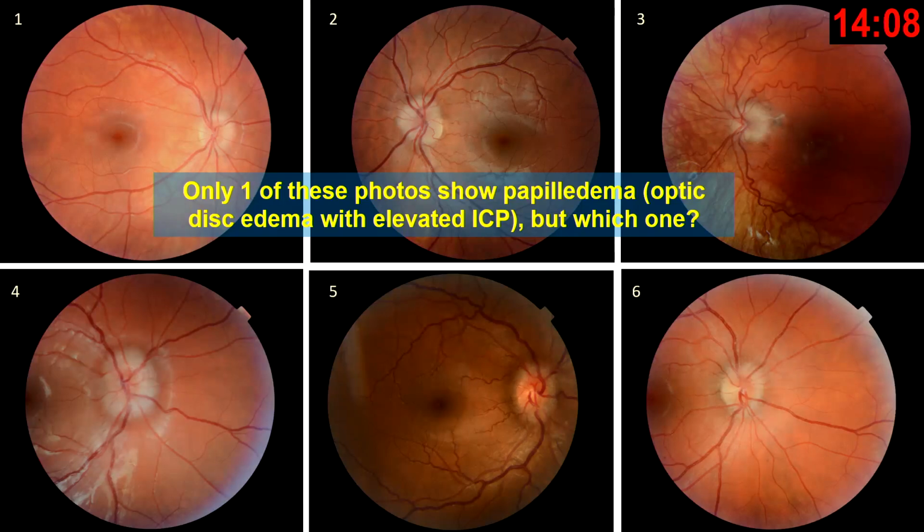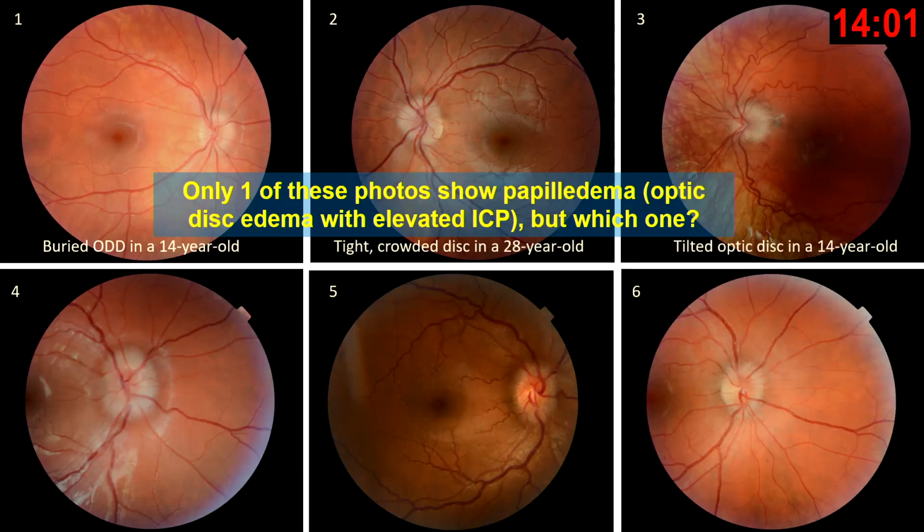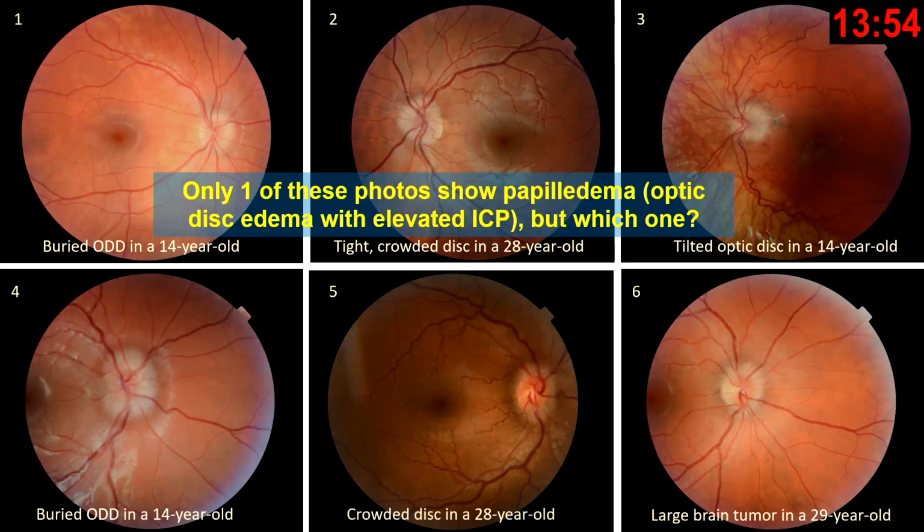1. All right. This is a buried optic disc drusen. This is a tight crowded disc. This is a tilted optic disc. This is buried optic disc drusen. This is a crowded disc. And here you have the tumor. Clement, you got it right.